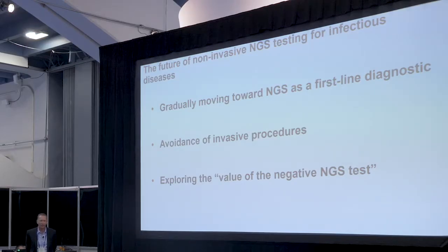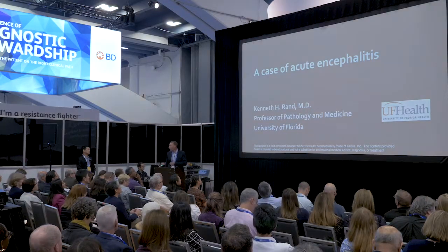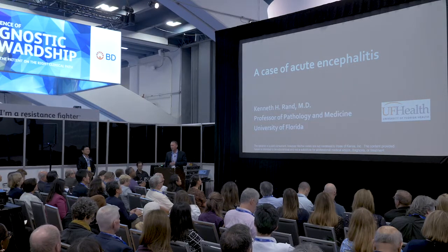Looking at things that look and act like infectious disease, but turned out to be bleomycin lung injury, we were able to de-escalate antibiotics and make that diagnosis, and feel relatively comfortable putting the clinical picture together that once we had a negative NGS, looking at everything else, we could take off those antibiotics and de-escalate as needed. So we're more and more utilizing Karius for the negative testing value that it brings to us. At that point, we'll do our questions for the end.